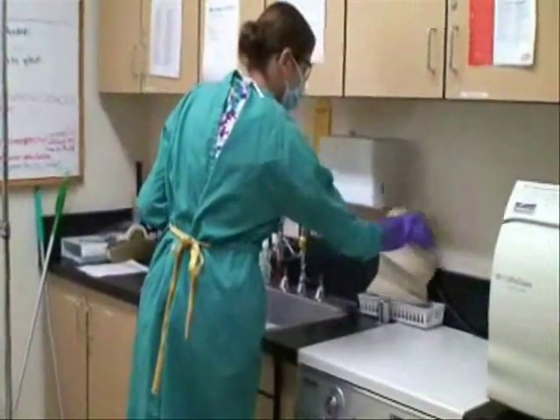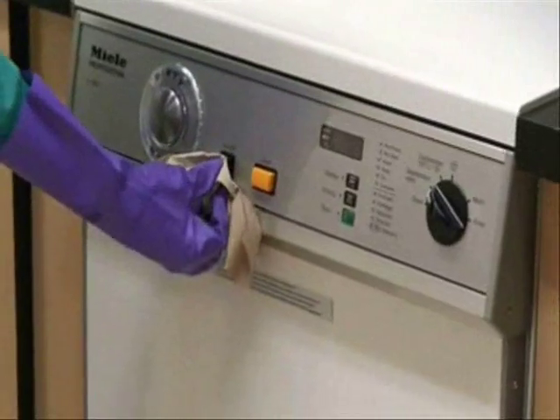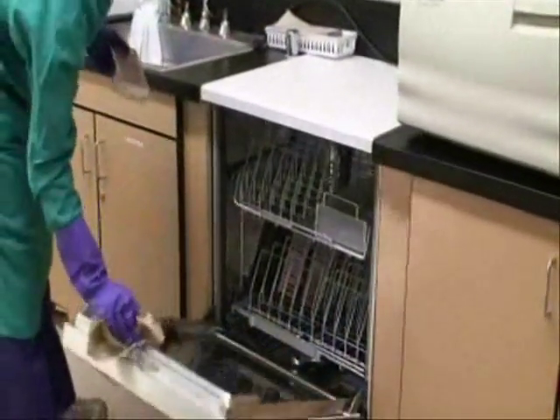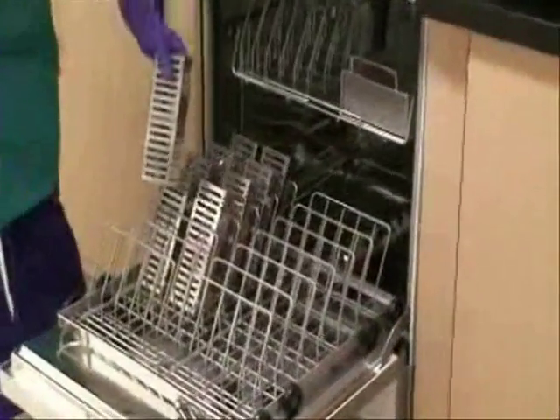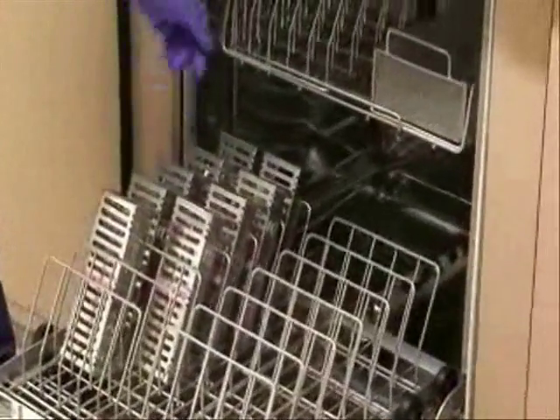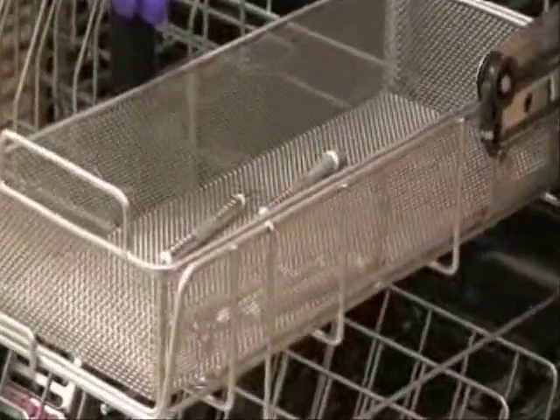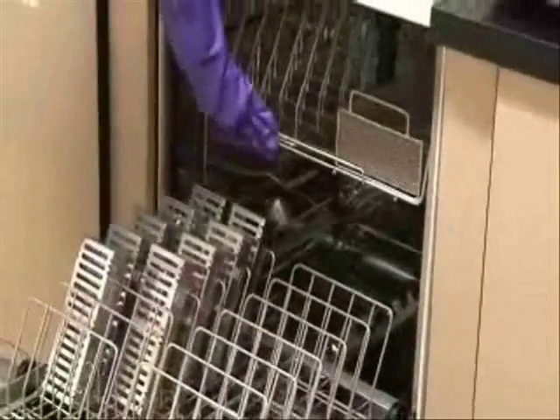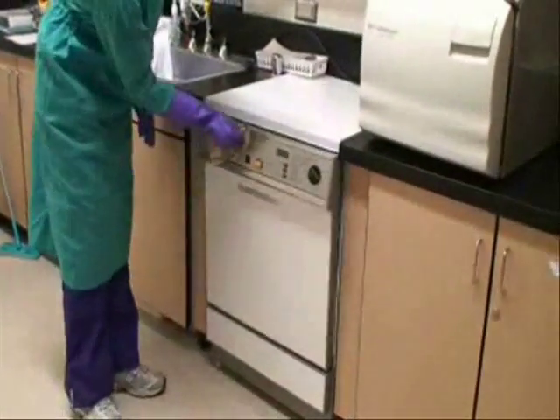Transfer the cassette to the sterilization area. Make sure the machine is on. Open the Millay door using a paper towel. The instrument cassette must be placed properly to prevent mechanical damage. Avoid overloading the machine for proper cleaning to take place. Single instruments should be placed inside the mesh basket. Close the Millay door using a paper towel.